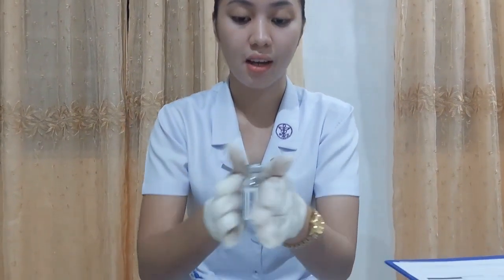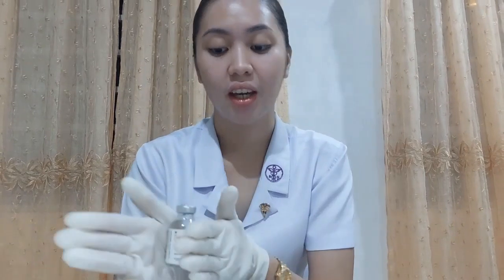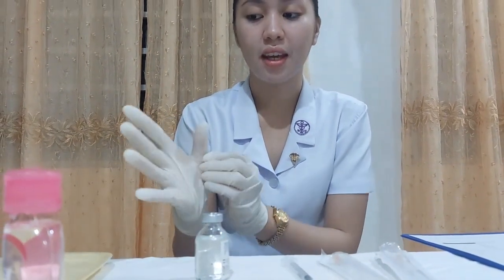So I'm going to mix the solution in this way. This is the proper way of mixing the solution inside the vial. We're going to rotate the vial in between the palms of both of our hands and not by shaking. Now that the solutions are mixed, I'm going to proceed in uncapping the vial.